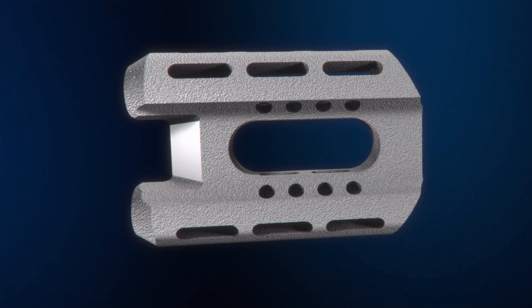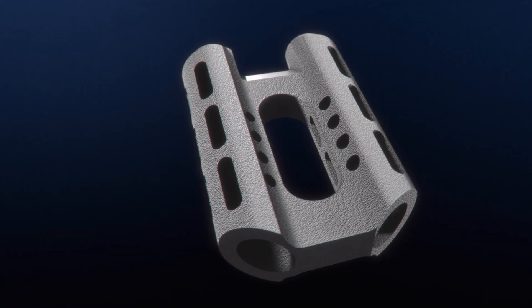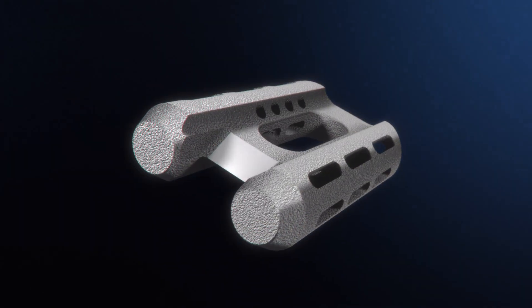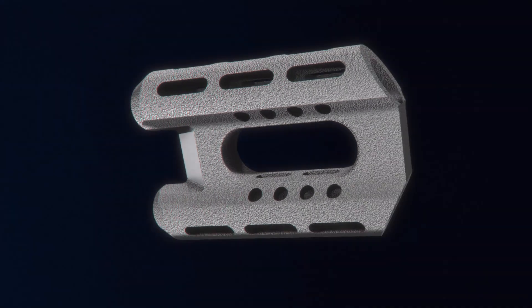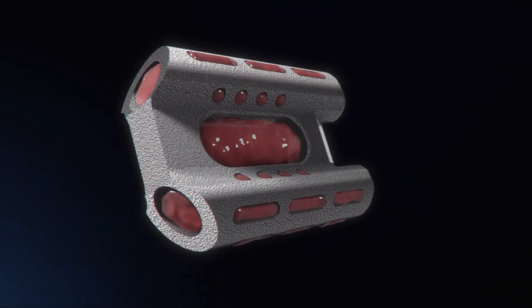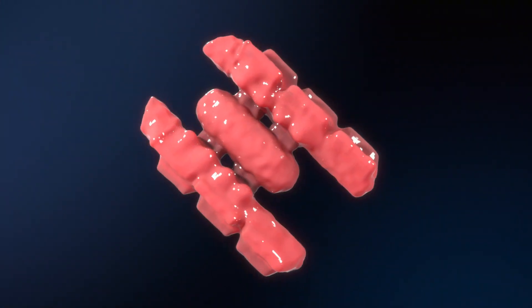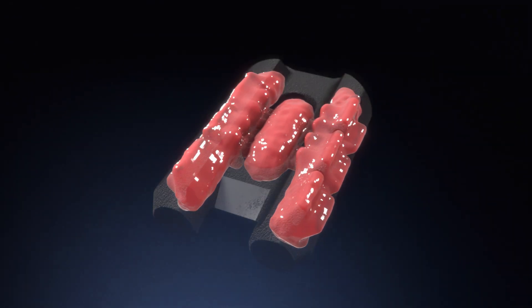The Catamaran SI joint fixation device is a single robust titanium implant featuring two pontoons and an osteotome bridge that is designed to transfix and disrupt the articular portion of the SI joint. Twin hollow and fenestrated pontoons deliver bone graft across the SI joint, providing stability to the SI joint.